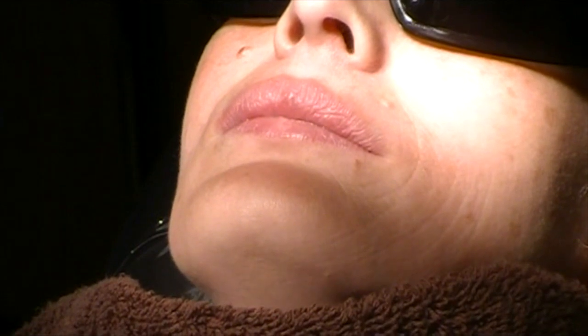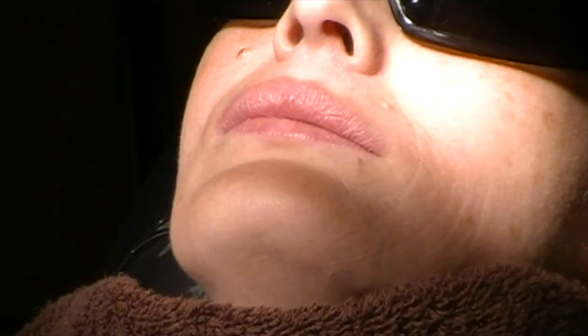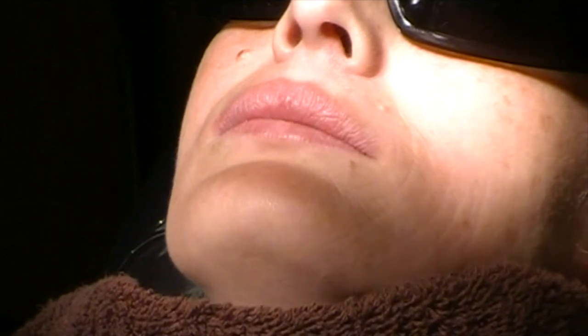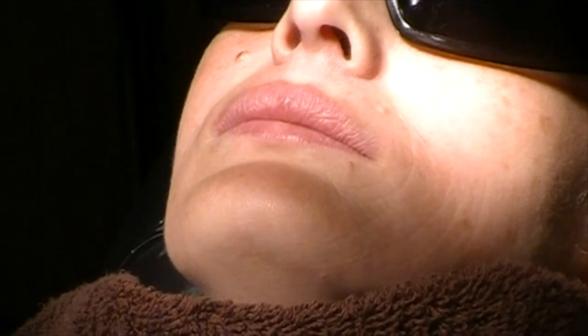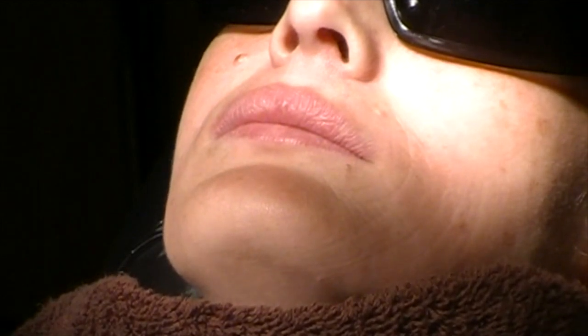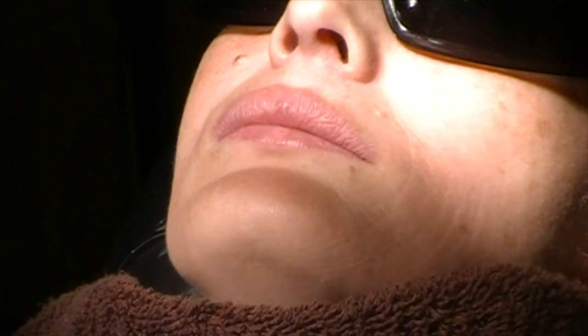We're going to do full mouth extractions using the physics forceps — the entire maxillary dentition that is badly decayed and the mandibular dentition. At the end of the procedure we're going to place two dental implants in the symphysis region in the cuspid region to support eventually an overdenture.